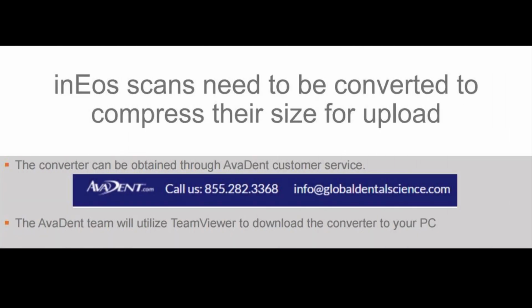In order to send files to AvaDent, you need to enroll in a program with them. When you enroll, they will install a converter on your computer that will help compress the size of the files. You can reach AvaDent at 855-282-3368, or you can get more information at info@globaldentalscience.com.